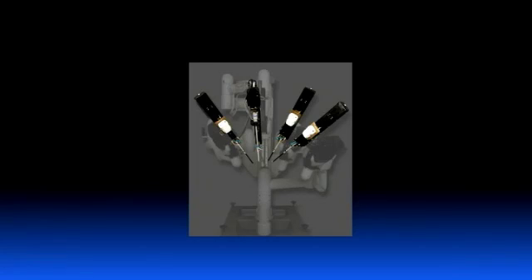We'll show you a more up-close view. This is, again, the device that attaches to the patient. These little metal ports are what go inside the patient. Those instruments that we use, the scissors, the graspers, the needle drivers, they make many different types of instrumentation. Those are popped in and out very quickly by your bedside nurse or surgical assistant. They just snap right out. If you want a scissor or 2 needle drivers, it's just real quick. You say, you know, you want a needle driver in arm number 1.